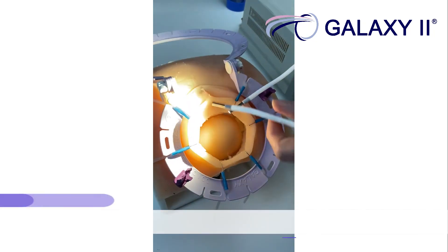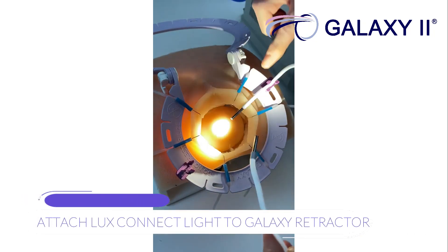Attach the connect light to the galaxy retractor using the light clips.